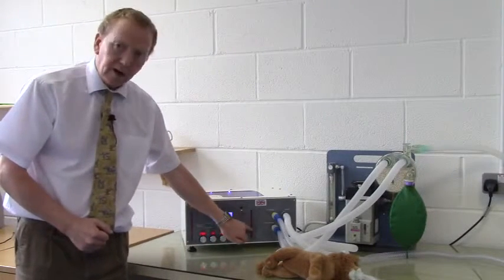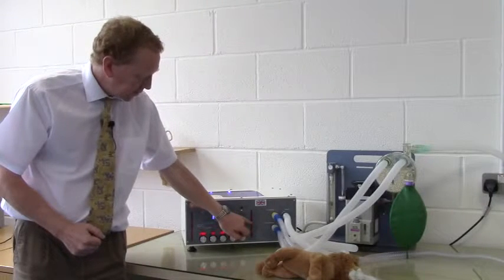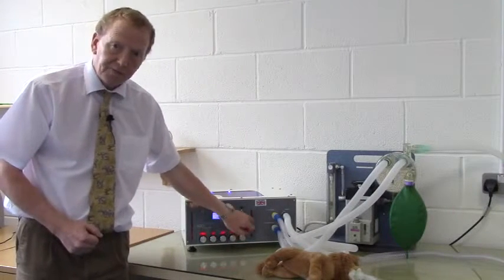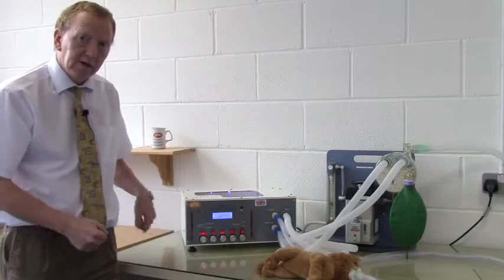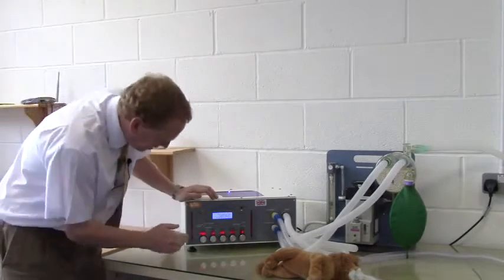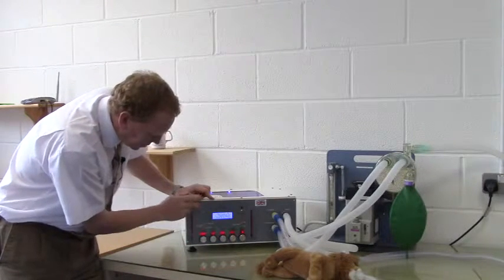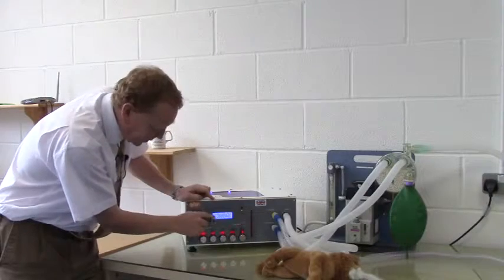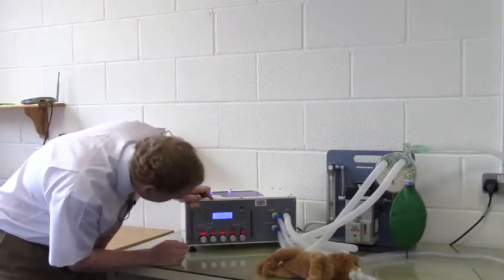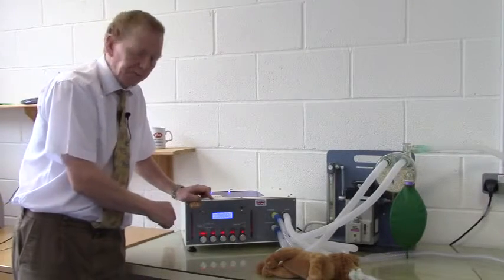The scale here is a guidance only, and it can be seen that it's going to just over 15-16 notches on this graph, and the same on here, so we would guess at about 15 to 16 centimeters. For accuracy, the actual pressure is constantly logged and shown on the screen on the line AP equals, and here we can see that actually our maximum airway pressure is getting to 18 centimeters.